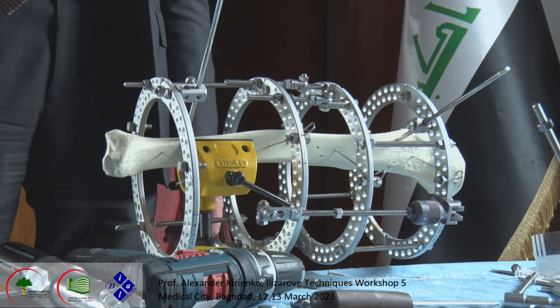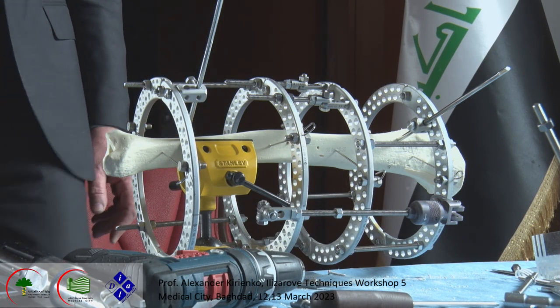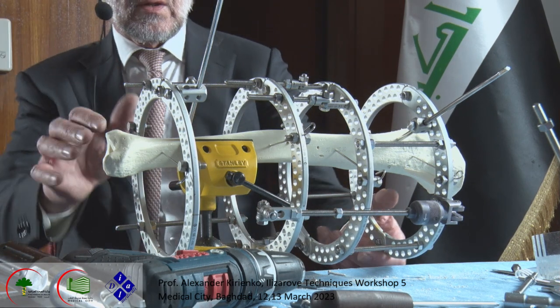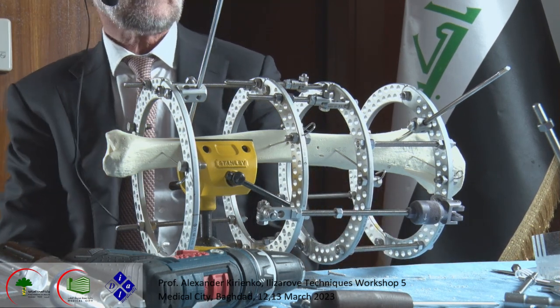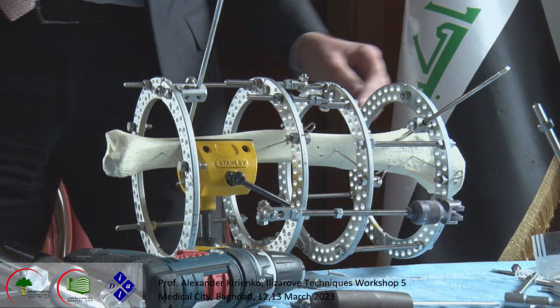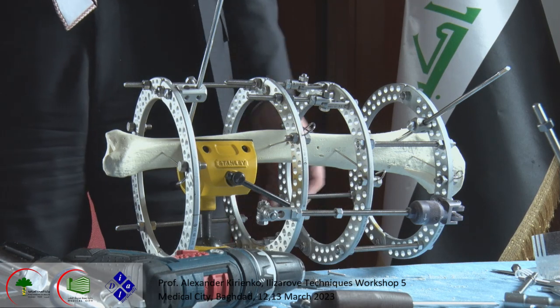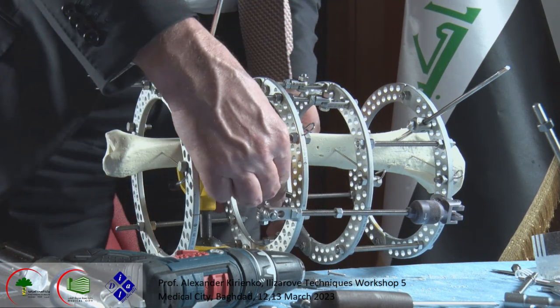This is the lateral view, but maybe it is inclined a little bit. Okay, and now we correct completely this varus deformity. There is no rotation, no other deformity.